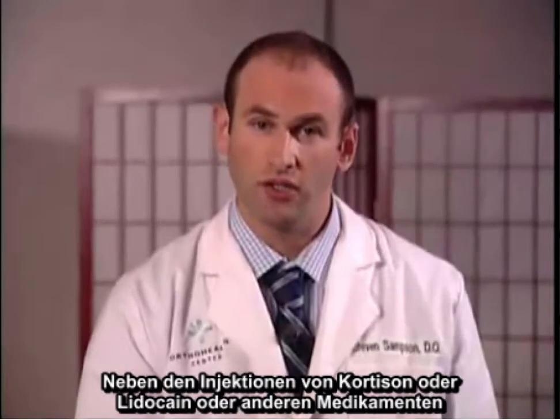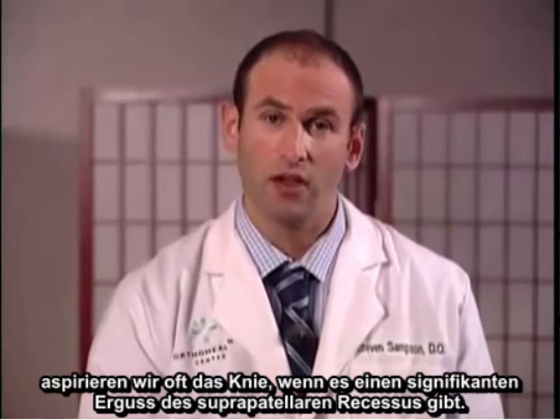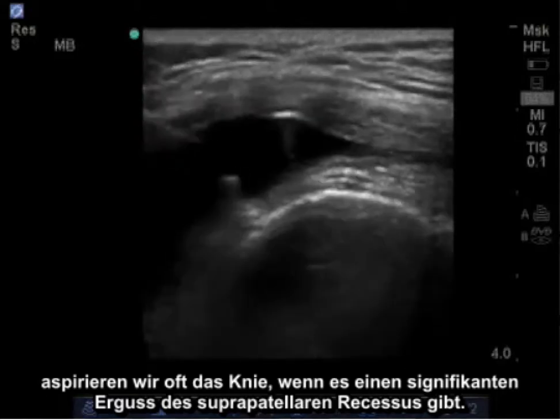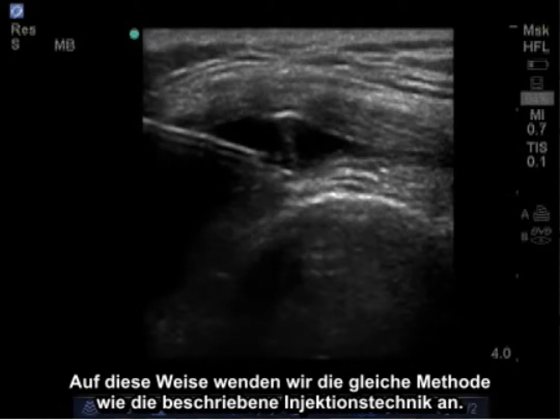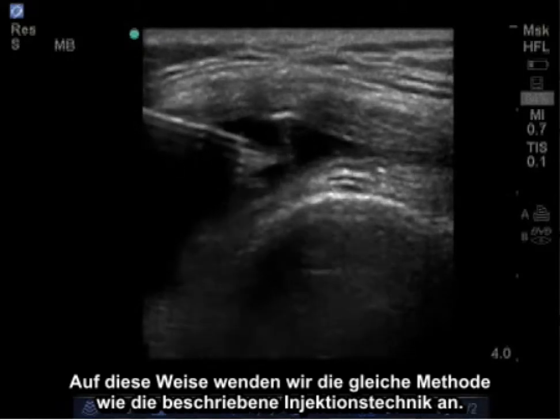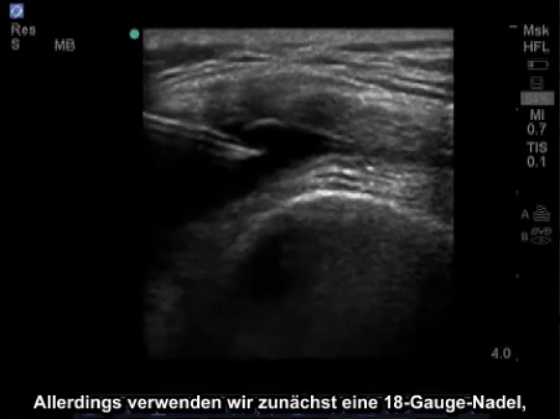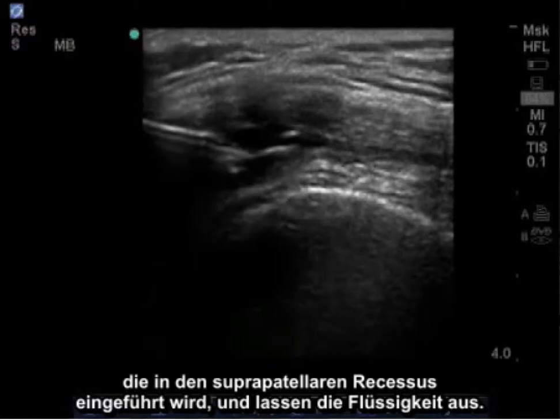In addition to injections of cortisone, lidocaine, or other medications, we often aspirate the knee if there is a significant effusion of the suprapatellar recess. By doing this, we use the same approach as the described injection technique; however, initially we'll use an 18-gauge needle, insert it into the suprapatellar recess, and drain the fluid out.